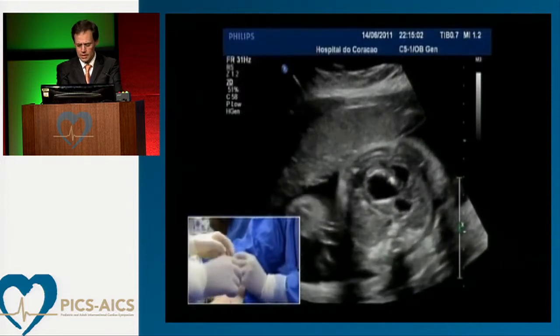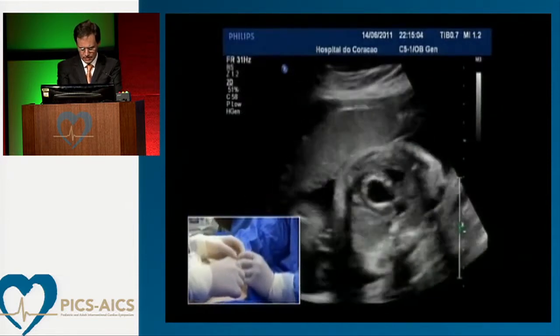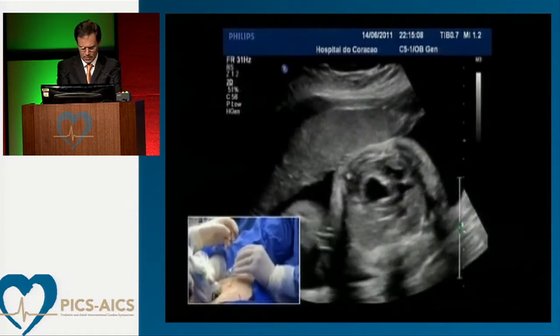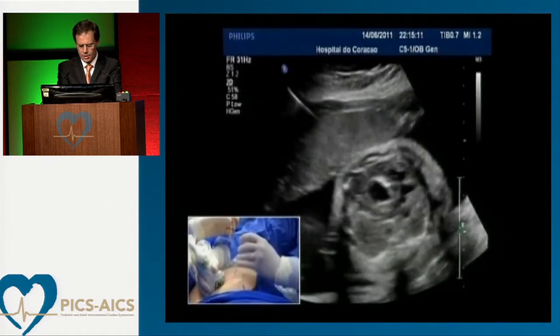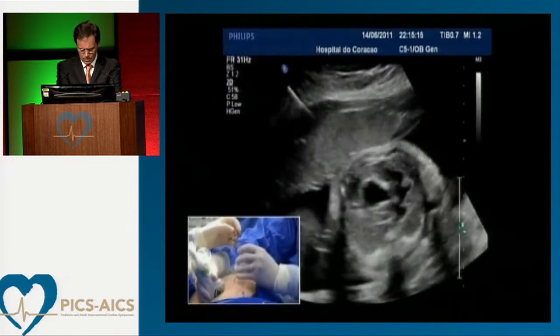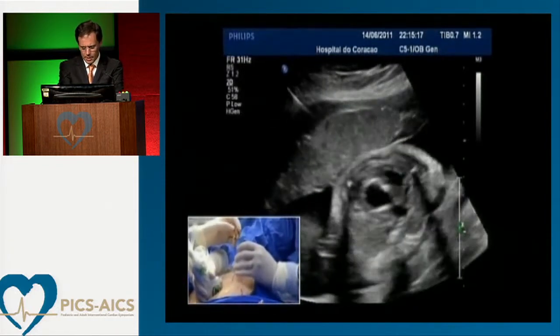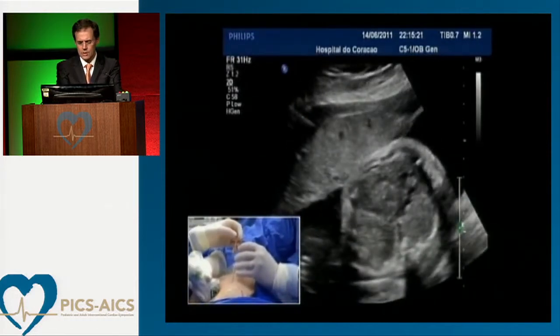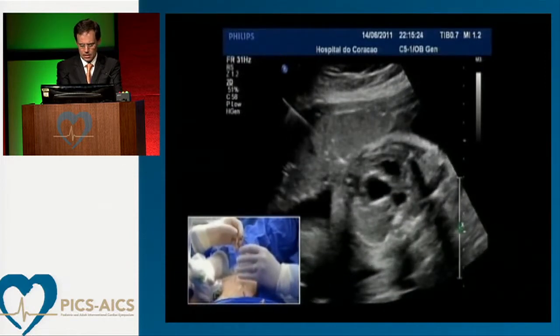Now the baby crashed. So there was some effusion, and Fabio used the other needle to drain the pericardial space. I think we sucked some, like 1 to 2 cc's, and then he recovered.